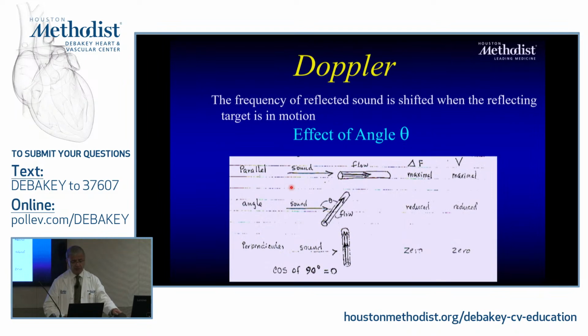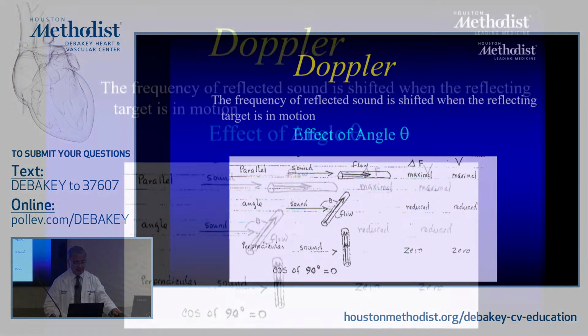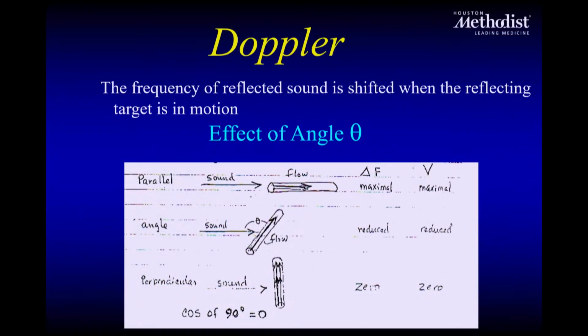And where angulation becomes important, if the angle is more than 20 degrees, 30, 40, whatever it is, you're going to underestimate velocity significantly. And that's why it's important, particularly for jets that you have no idea where they're going. Aortic stenosis, you cannot tell which direction. That's why you do multiple windows and you take the highest velocity, which implies the lowest angulation that you've had, right?